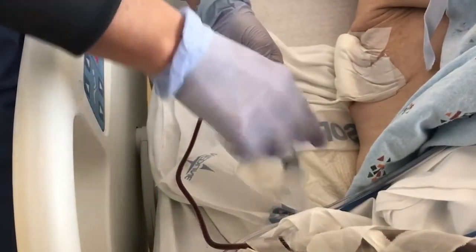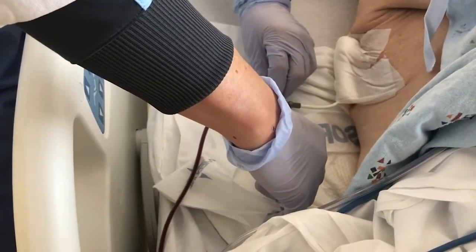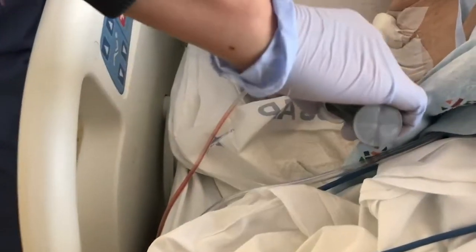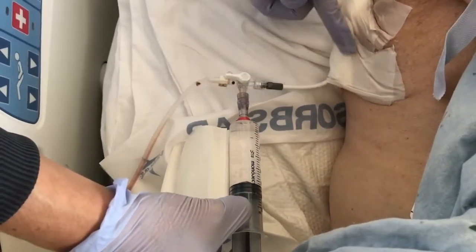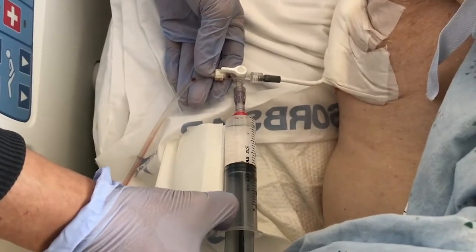Now the flow is directed only between these two, so it flushes really easily. You don't necessarily need to do the whole syringe — you can just flip it and flush the rest into the tubing. Now we can go ahead and insert the medication. The TPA and pulmozyme are prepared in two separate syringes, but it does not matter what sequence they get put in. Open up so that you can instill the medication into the patient — the channel to the tubing is off — and instill it.